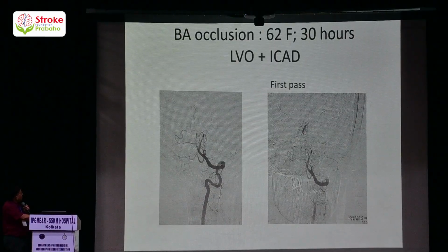Another case, basilar artery occlusion, a 62-year-old female, who presented late to us. In this case the intervention was done 30 hours after the onset of the stroke.